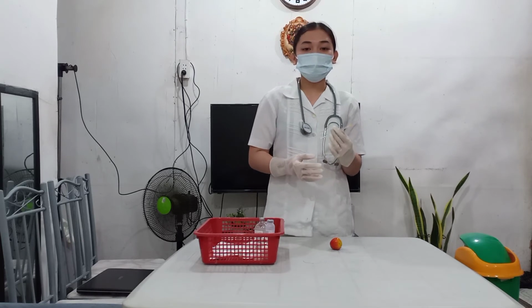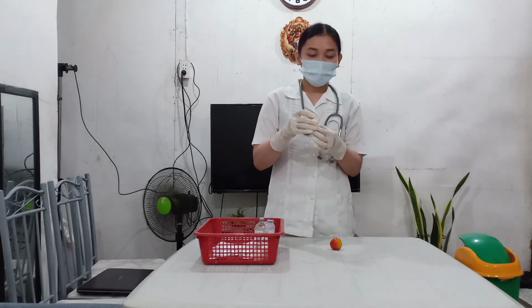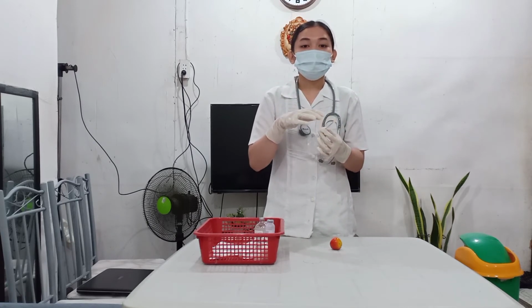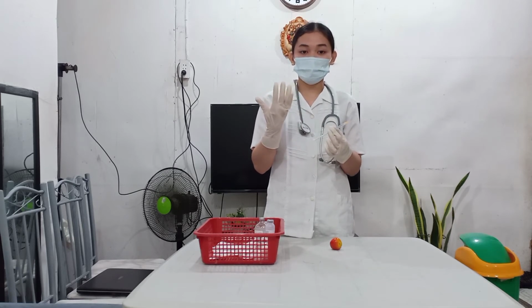Now, we grasp the syringe in our dominant hand close to the hub, holding it between the thumb and the forefinger. This position keeps my fingers off the plunger, preventing accidental medication loss while inserting the needle.